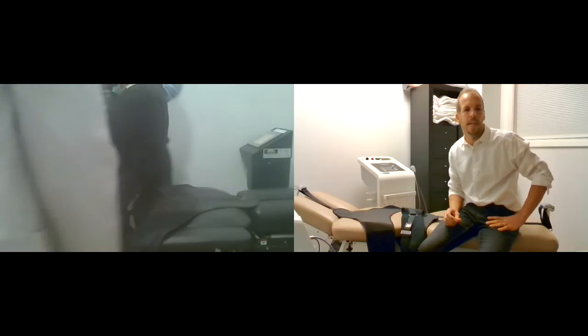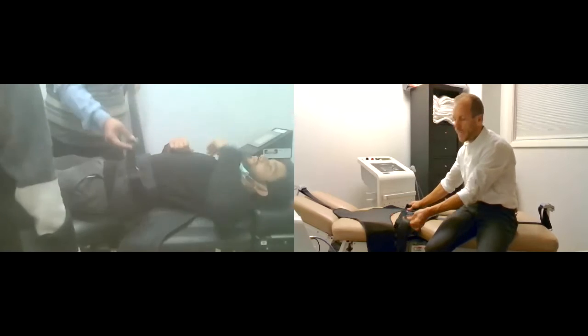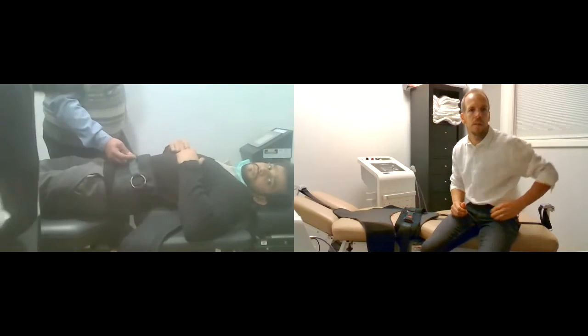Okay, go ahead and have him lay back down. Now when you bring it across, all the extra fabric should be on the same side as you. Okay.